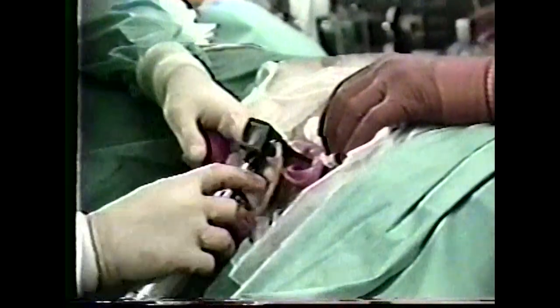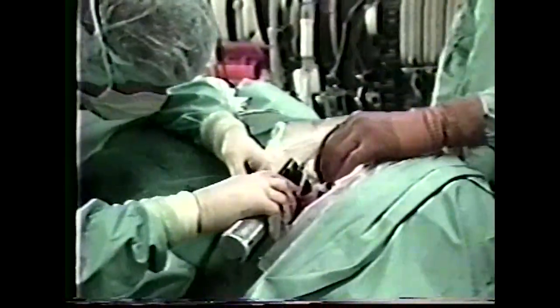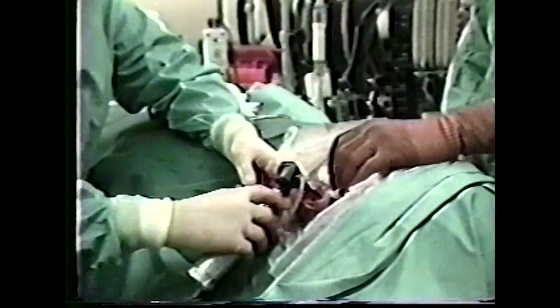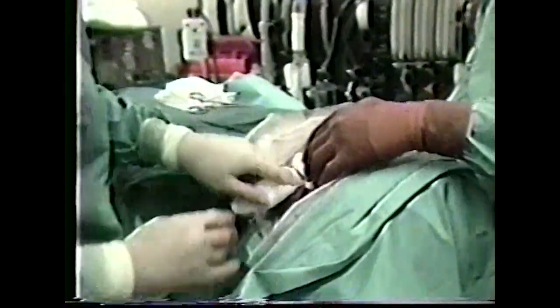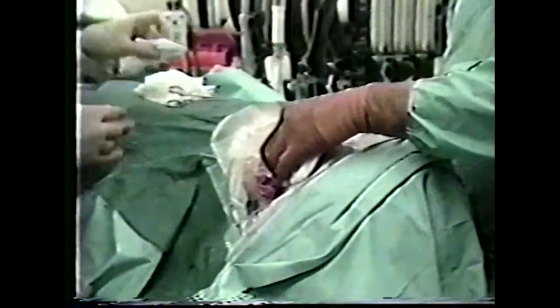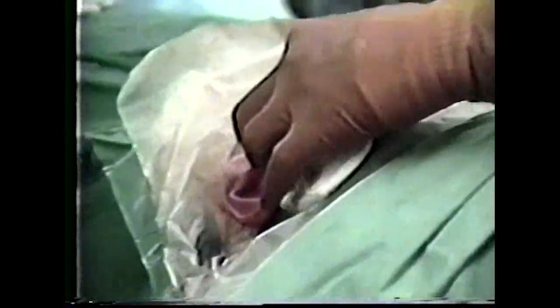At the conclusion of surgery, the external auditory canal is carefully examined with an otoscope for foreign matter or iatrogenic damage to the tympanic membrane. And placement of the external Band-Aid dressing.